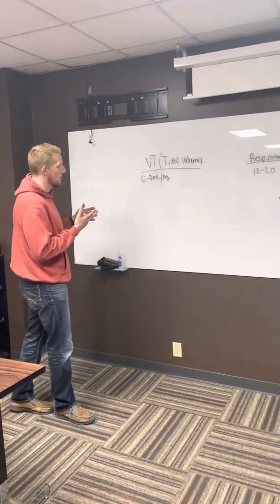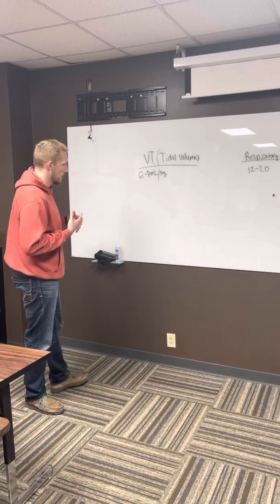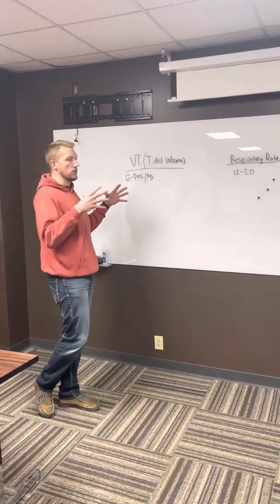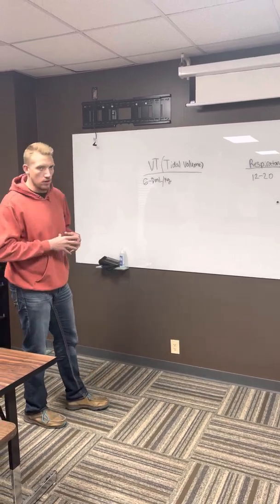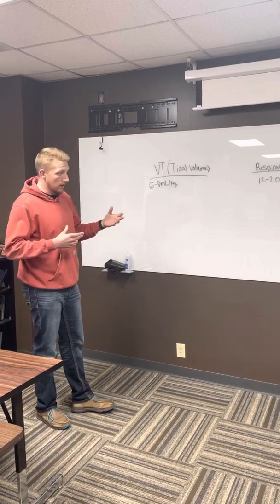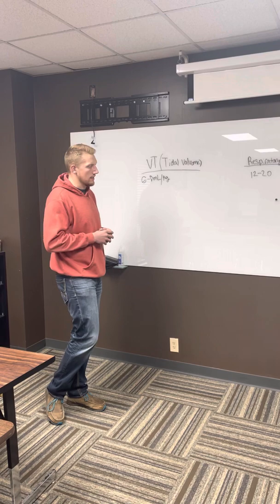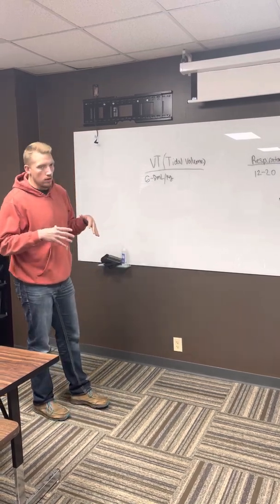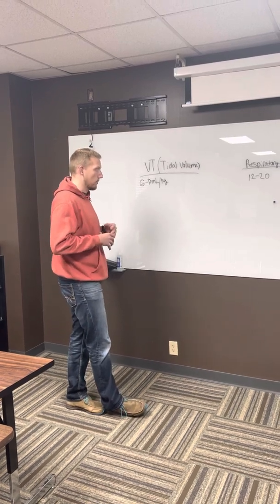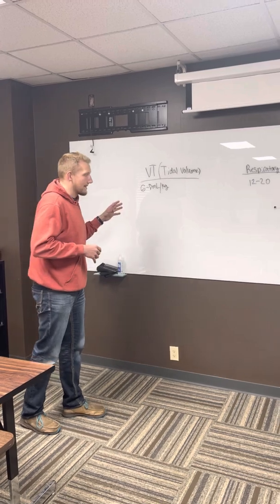So your tidal volume is in milliliters, and we base that off of weight. It's 6 to 8 mL per kilo, and so that's just the full expansion of the lungs. So the total volume to which our lungs can expand. That can vary between different kinds of lung compliance. If we have a high compliance, we have good elasticity of the lung, and if we have a low lung compliance, it very well could be lower. And so we want to watch how much tidal volume we're actually giving these patients, and we want to give them an appropriate amount. So that's tidal volume.